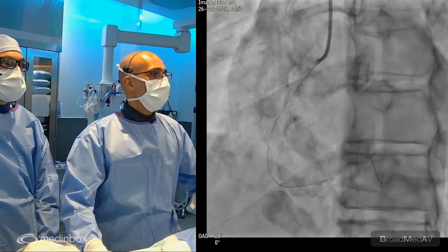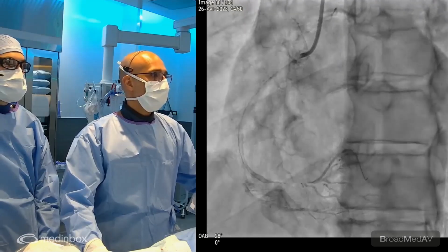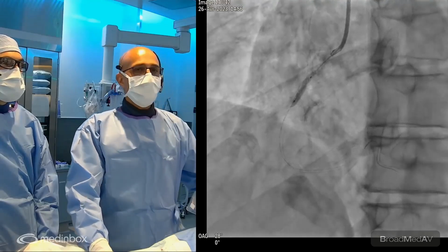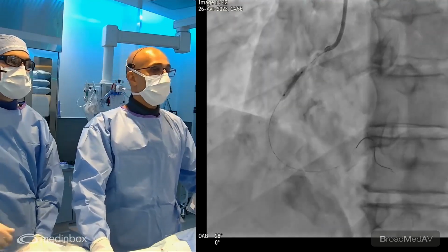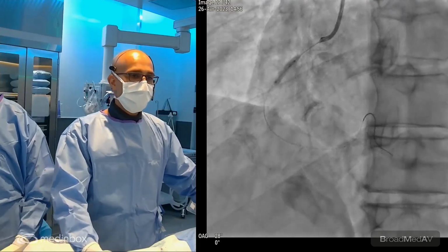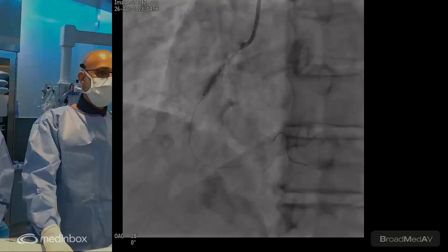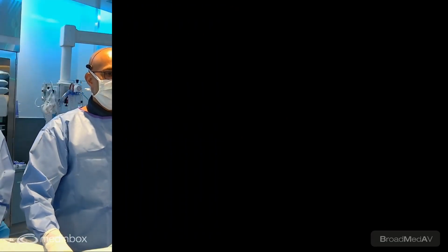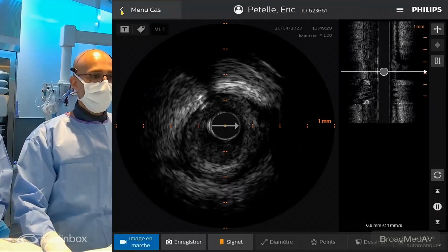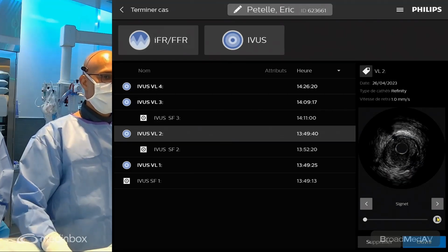We took an image post-atherectomy. We had some spasm in the PDA that would come back later on. Next. Then I performed pre-dilatation. We performed IVUS. So let's see the IVUS first before the pre-dilatation. So the first image of the IVUS. So imaging is extremely important in cases like this because it gives you a good idea of the distal vessel. We measured 3.0 as a distal landing zone. Can you play the first IVUS, please? We want to play it fully.